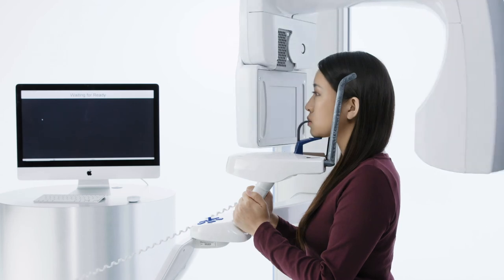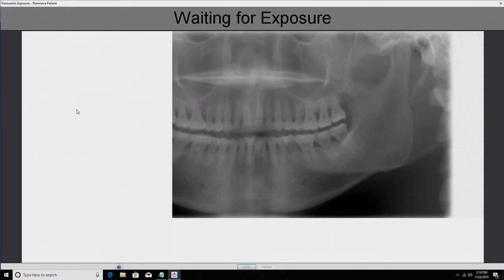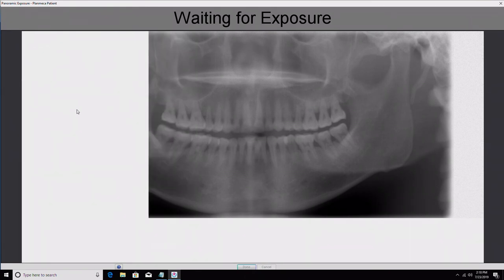Press and hold the exposure button until all audible noises cease. The image will appear on your computer screen. If your imaging software requires you to save the image, press OK or Done where applicable.